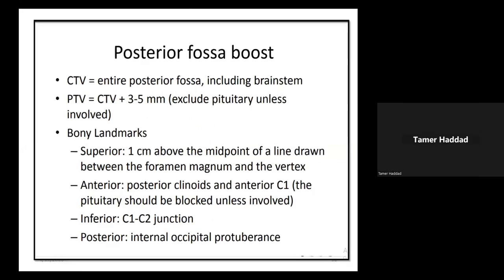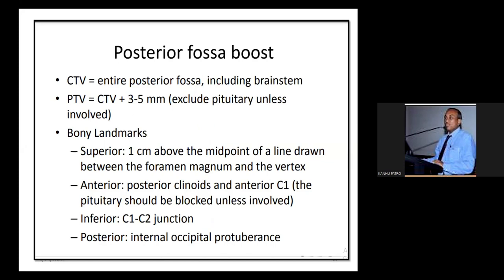Posterior fossa boost is again an important marker. As another step, you have to find out whether you should go for the whole posterior fossa boost and/or tumor bed boost. Remember, no need to include the pituitary and cochlea in the posterior fossa boost.